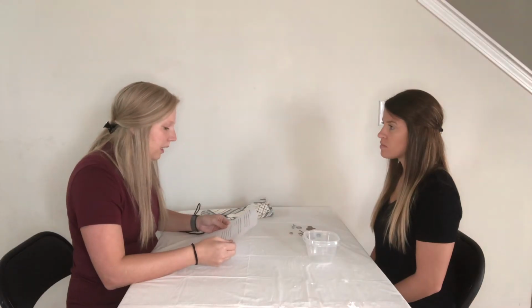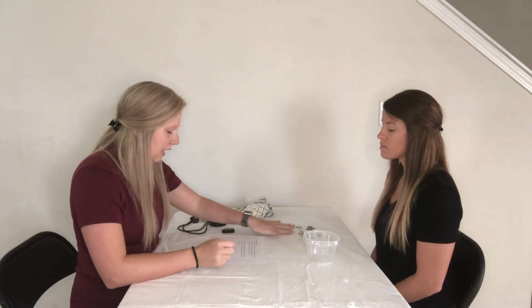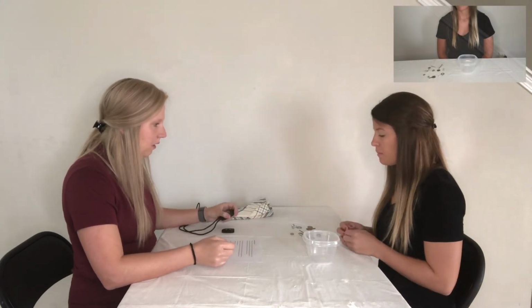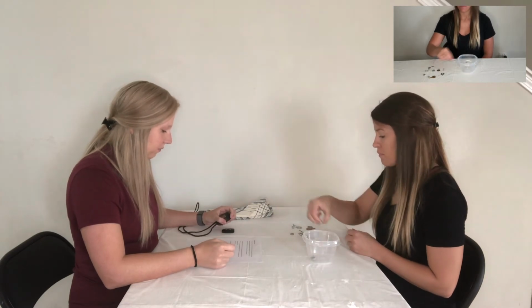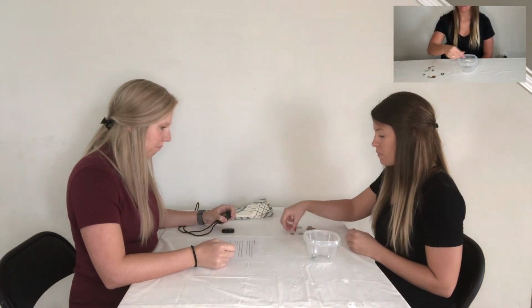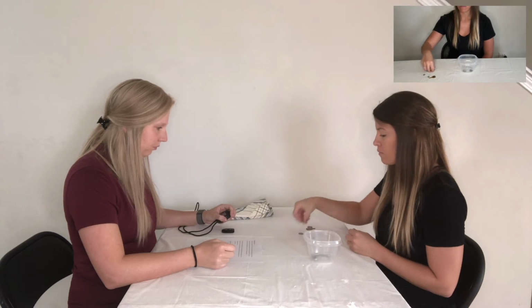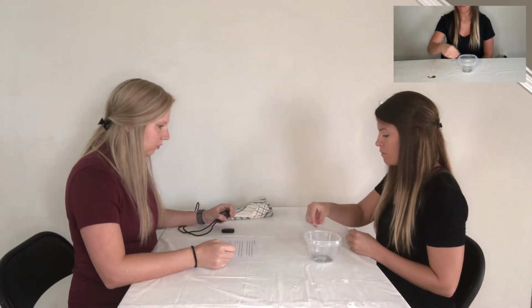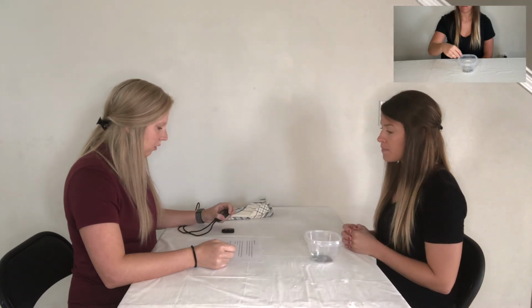You will begin by picking up the items one at a time and placing them into the container as fast as possible. You are not allowed to slide the objects on the platform when picking them up. You may begin when I say go. Are you ready? Yep. Go. Okay.